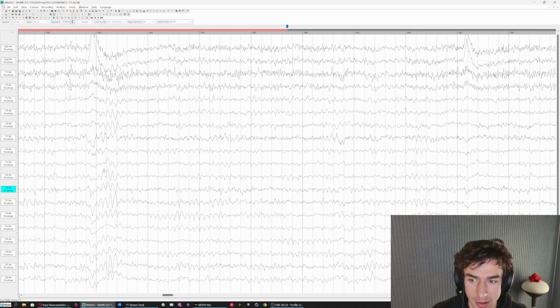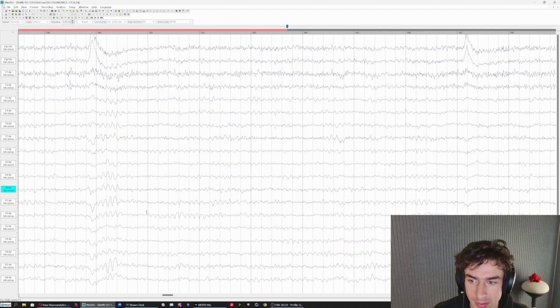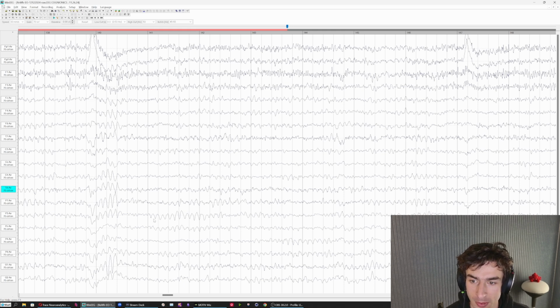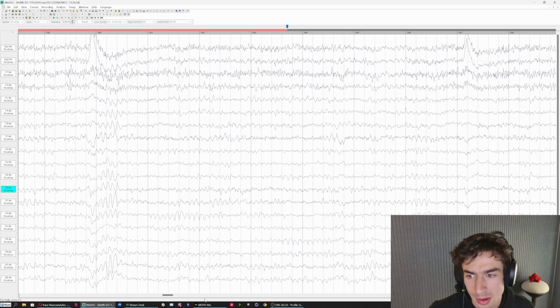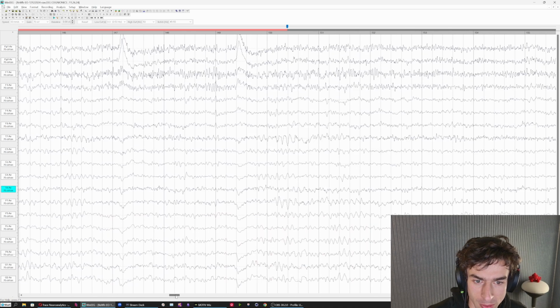We're noticing a pattern after the eye blink. We see sort of a little resurgence of this posterior alpha activity, which is quite common. And we see some of this activity here at P3, which looks like it could be mu activity, although we would tend to see that at C3 and C4. I only say that because it has a slightly more monomorphic, pointy appearance than the rest of the alpha that we saw earlier. So not really a finding, but something to keep our eye out for.